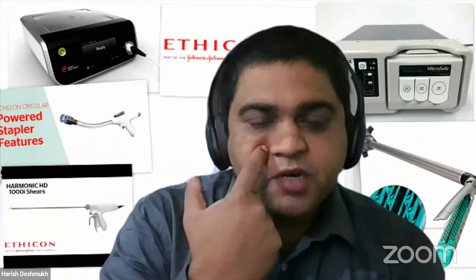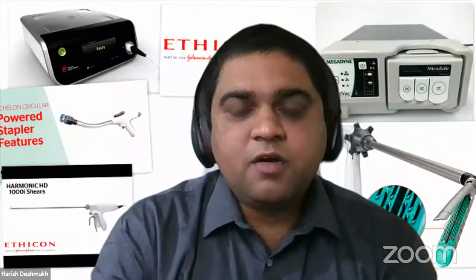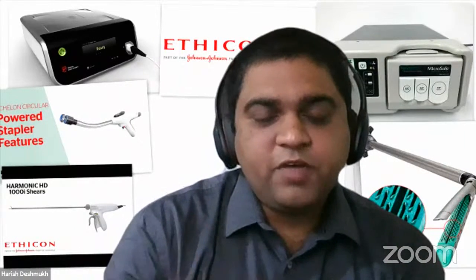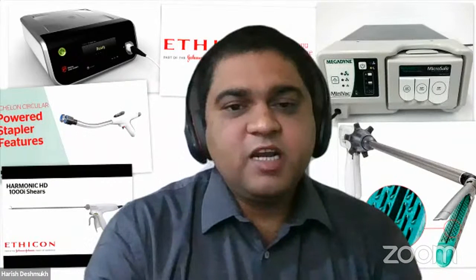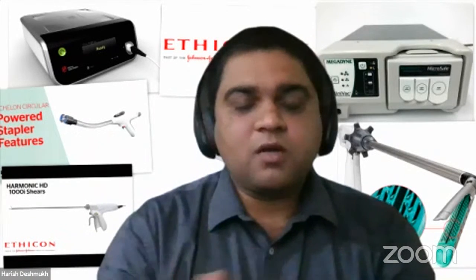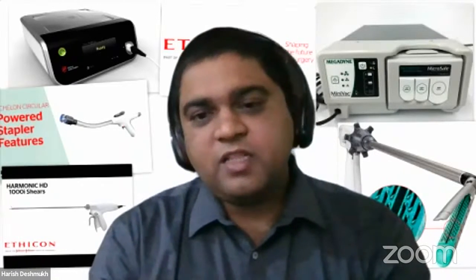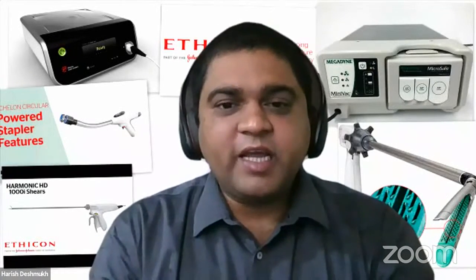For example, we are doing a total or subtotal gastrectomy where the antrum, or part of the antrum or duodenum, has been resected, and we are doing a jejunum anastomosis to the body of the stomach. In this case, stomach thickness is relatively intermediate, and the small bowel tissue thickness is slightly lower. So we should use a product which gives us both comparatively. Seeing the tissue thickness, it is recommended to use either blue or green, but again, it depends on the tissue thickness.